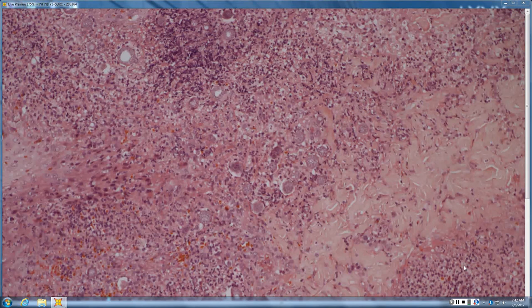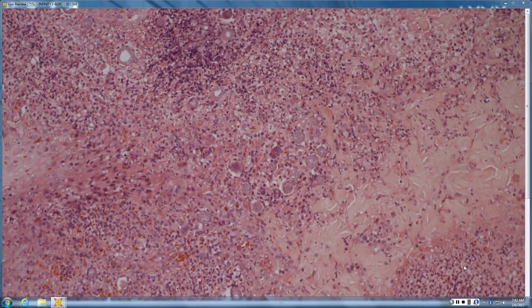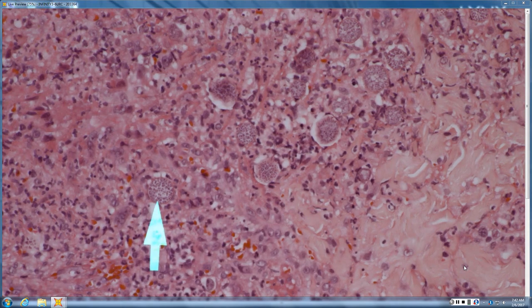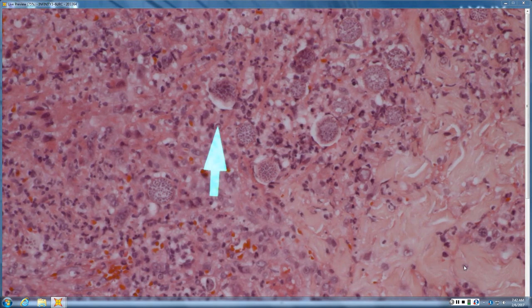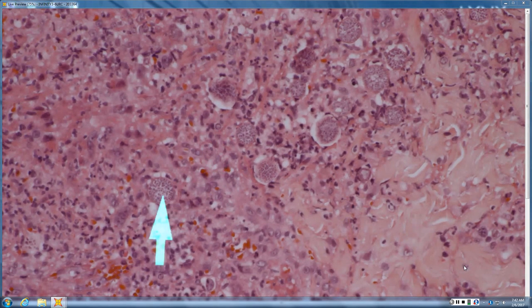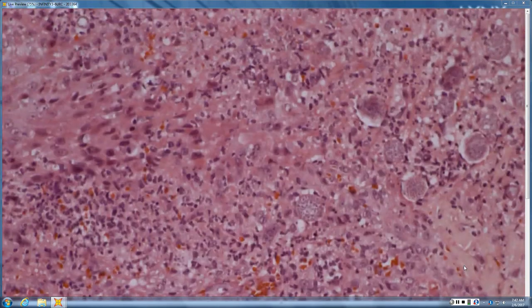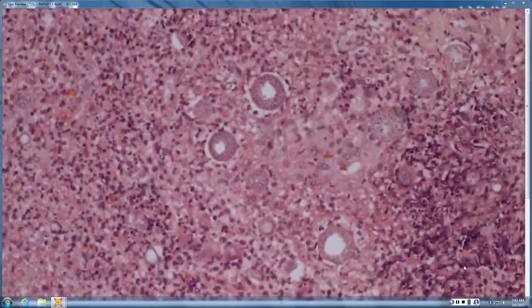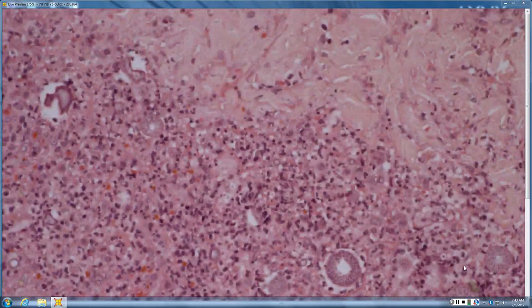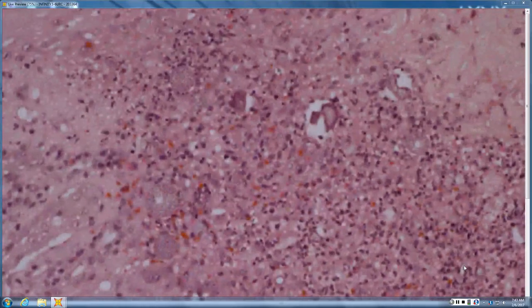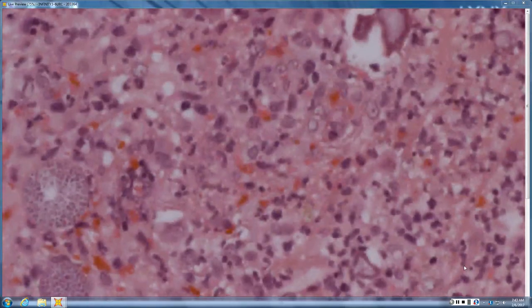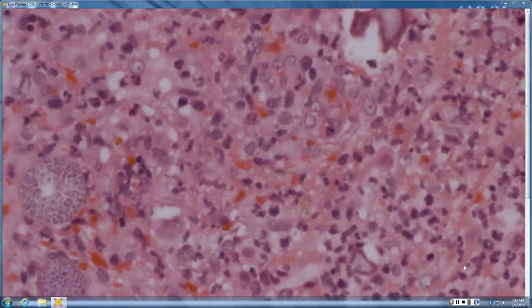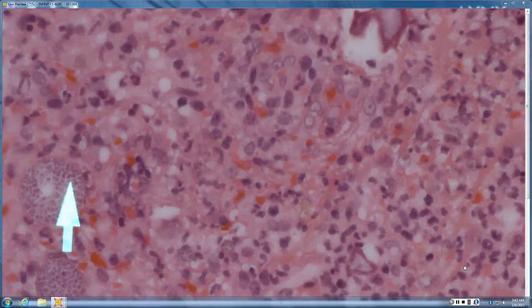Yeah, so there's some larger kind of process of the epidermis. I don't know if they're like endospores inside of those things, but they're certainly bigger than the monitoring cells like the cocci. They certainly have endosporulation, which is one way that cocci can appear. The other way that it appears actually more commonly is with the lacy cytoplasm without the endospores, which we'll see examples of.